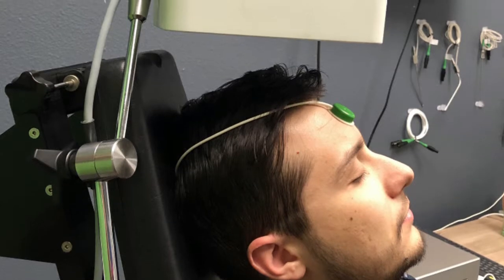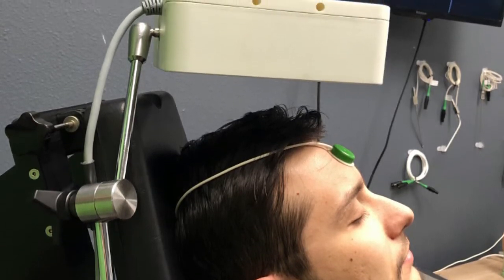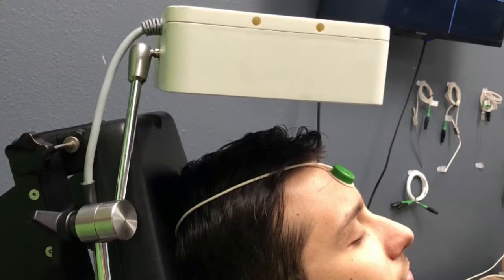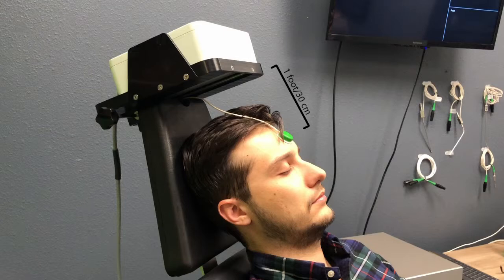In this second example, the field generator is attached to a flex arm, which is aligned in what is known as the baseball cap position. When positioning the field generator, it is important that the F symbol is faced towards the patient's head, as this is the direction in which the magnetic field is generated. It is important that the patient's head be centered within the magnetic field throughout the procedure. The patient's head should be no further than 1 foot or 30 centimeters away from the field generator.